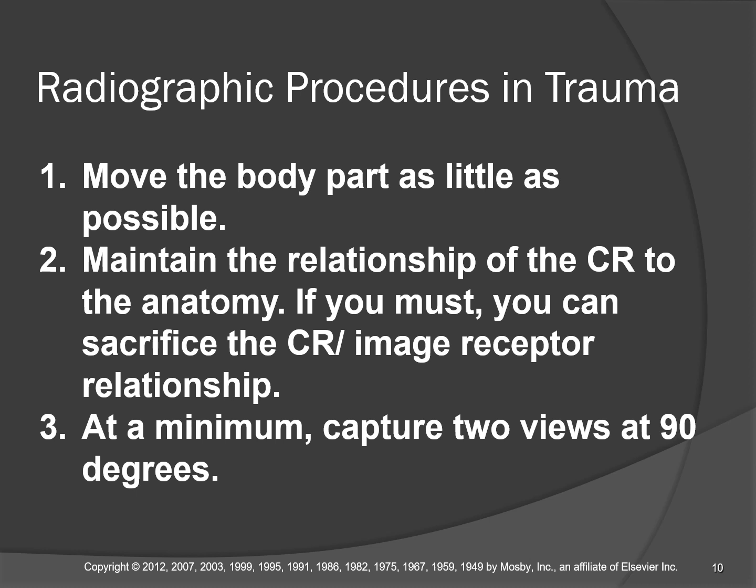So the direction of the beam to the anatomy is a very specific relationship. The photons don't go through the joint spaces unless the opening for the joint space is kind of facing back toward the X-ray tube.